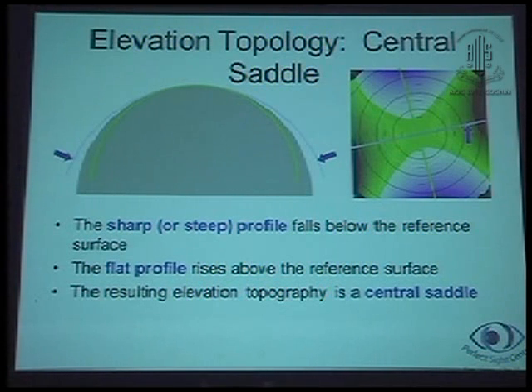Now what I'm going to discuss here is basically a little difficult to understand. In elevation-based topography, you see there's this dark green line and a blue line. The curvature, rather, the dark green one, what you see in the center is the best fit sphere. If this were the common point, the dark green is the steeper cornea, you'll see the periphery of this cornea going below, or posterior to, the best fit sphere. Therefore this periphery would be depicted by a cooler color, that is the blue color. If you see this dark green line, the periphery becomes blue.